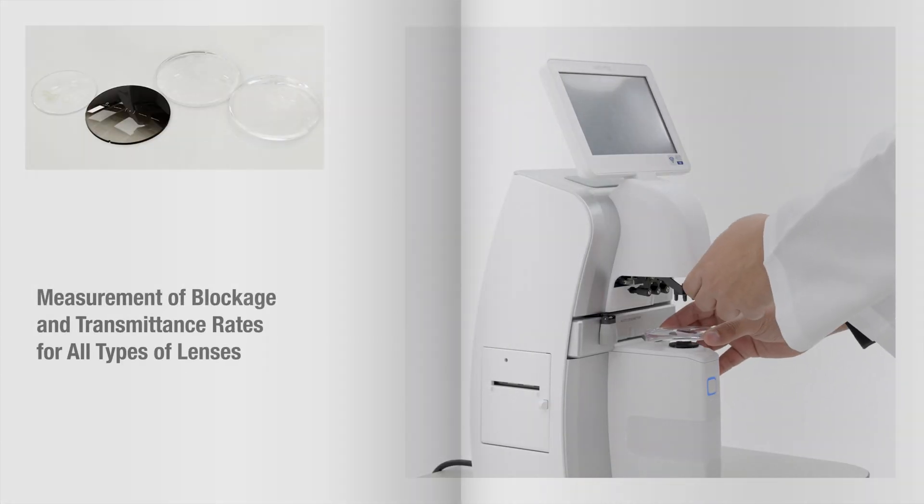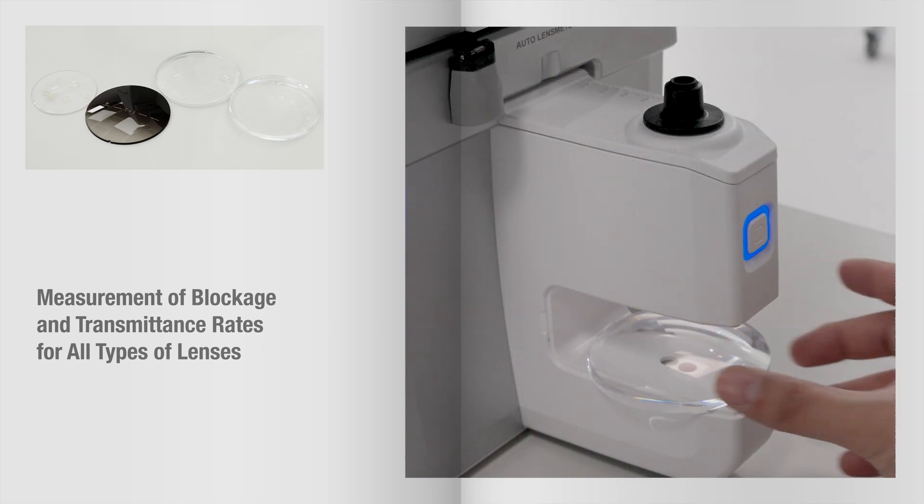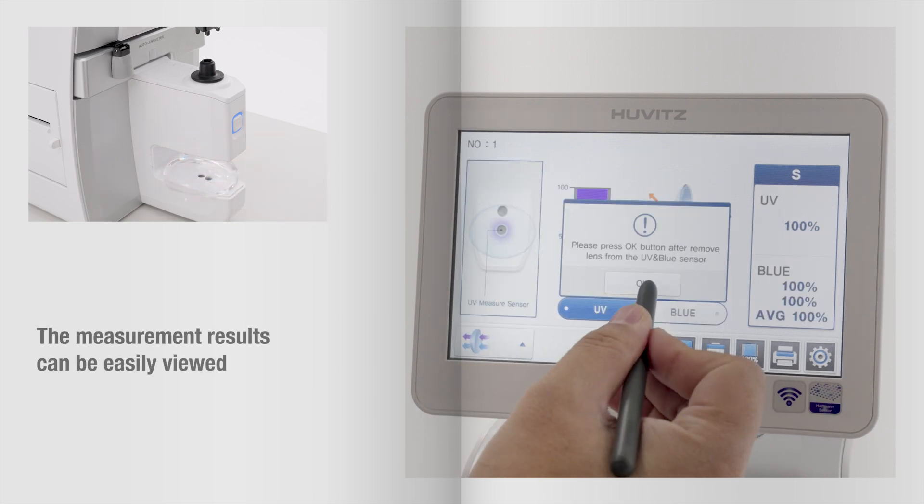The blue light blocking rate, visible light transmittance, and UV transmittance are all conveniently measured. And the measurement results can be easily viewed.